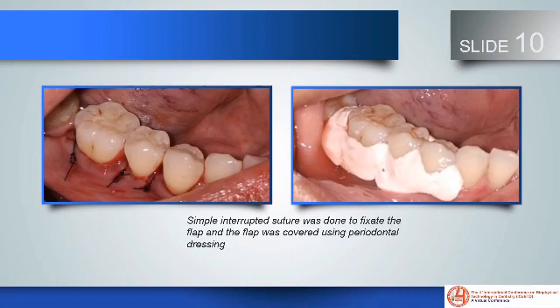Simple interrupted suture was done to fix the flap, and the flap was covered using periodontal dressing. Post-operative instructions were given, and amoxicillin 500 mg, mefenamic acid, vitamin C, and metronidazole were prescribed.